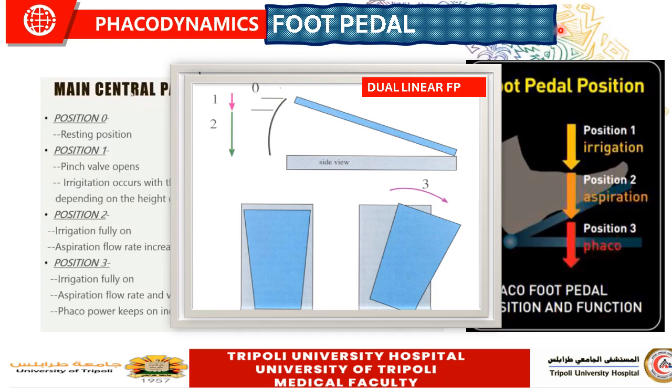That's to say, if you preset your vacuum level, for example, at 200, programmed linearly, so that in the middle of stage 2 or position 2 you reach 100, at that point you want to switch to ultrasound. Just by clicking the foot switch to the right side, this will execute the ultrasound, and you will have ultrasound energy at a vacuum level of 100.